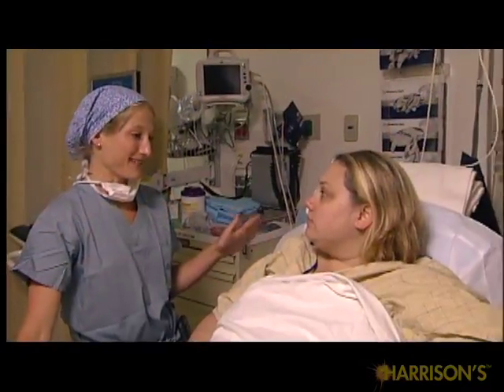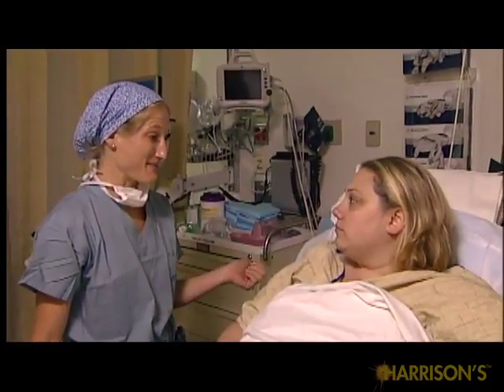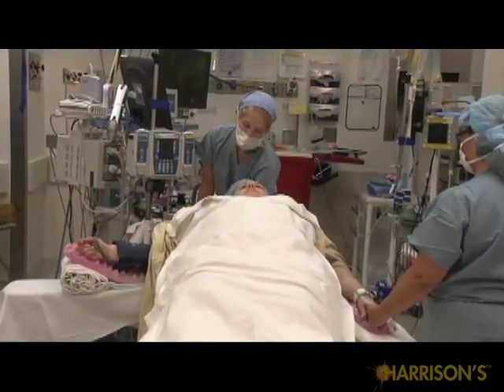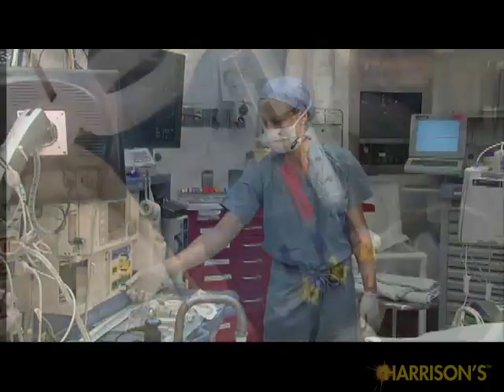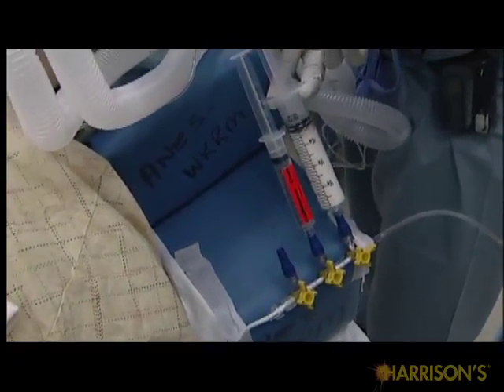To review, critical steps for endotracheal intubation are the following. Elicit key features of the history and physical that may predict difficult ventilation or intubation. Assemble equipment. Position patient properly. Pre-oxygenate with 100% inspired oxygen. In conscious patients, administer an induction and paralytic agent.